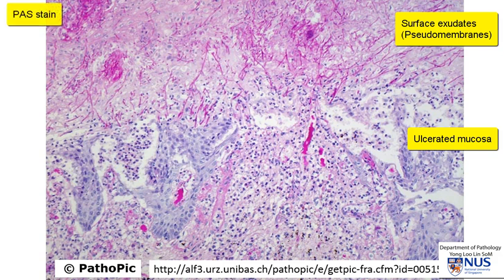What we are looking at is a PAS stain — periodic acid-Schiff — and this stain highlights fungal elements very well. So here we can actually make out thin fungal hyphae and some small yeast forms as well.